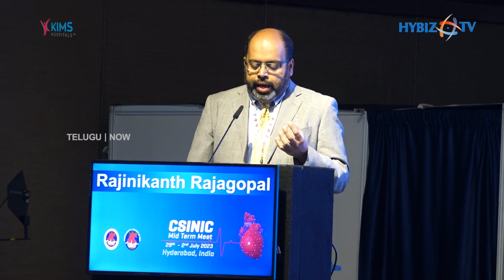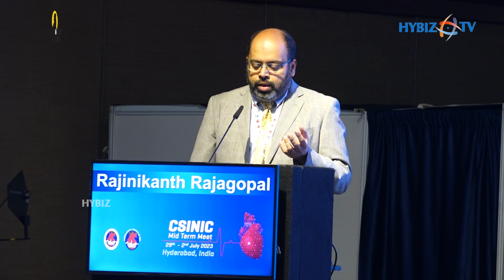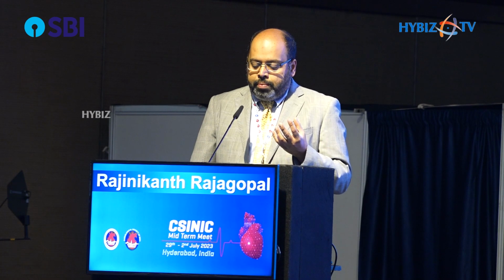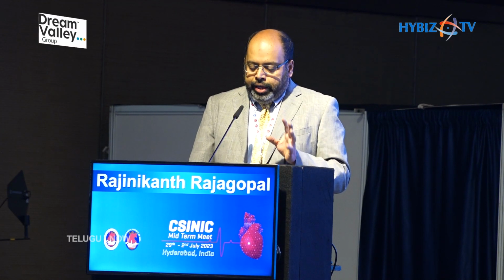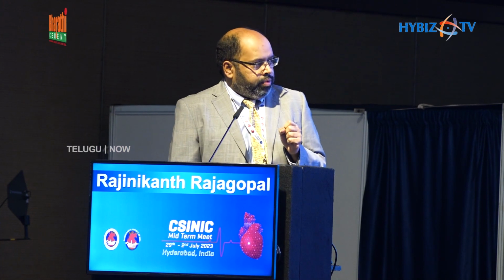Stents only if you have really exceeded the expansion limit of the previous stent, then you have to put a new stent in. For biological problems, a scoring or cutting balloon for neo-intimal hyperplasia. If it's neoatheroma, you look at if there is much calcium. If there's a lot of calcium, you have to think about cutting balloon, IVL, and rarely rotablation. Reassess with imaging or angio, and finish with the DEB mostly, but DES if there is significant residual stenosis or flow-limiting dissection.